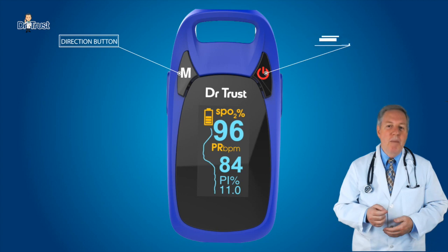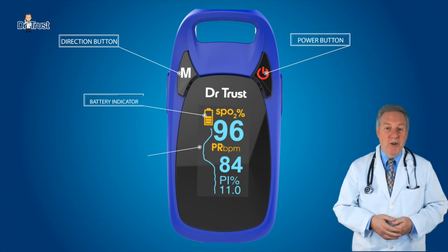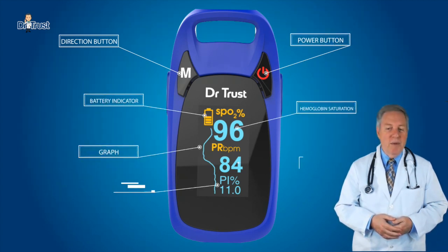The oximeter can be used to measure human hemoglobin saturation, perfusion index, and heart rate through the finger.